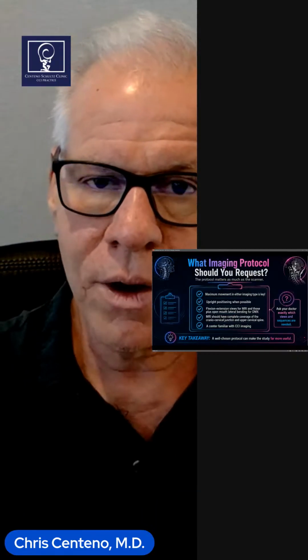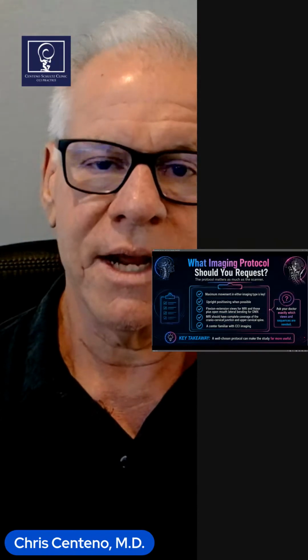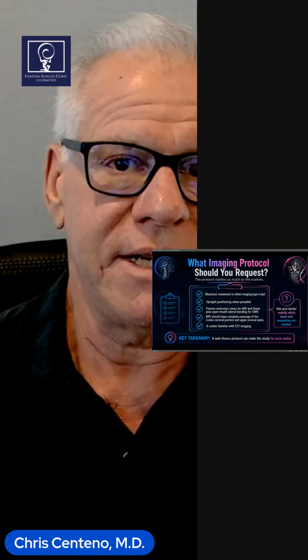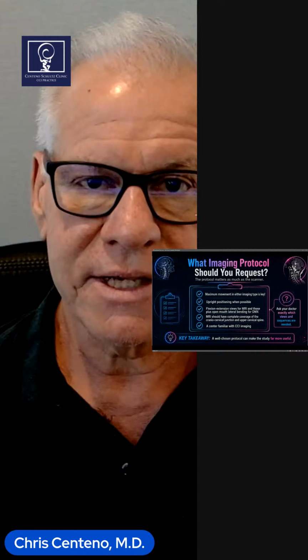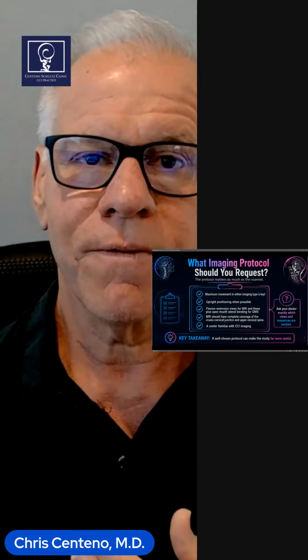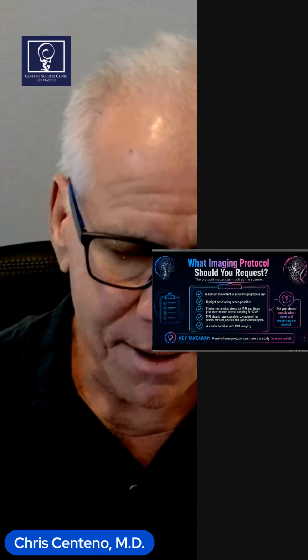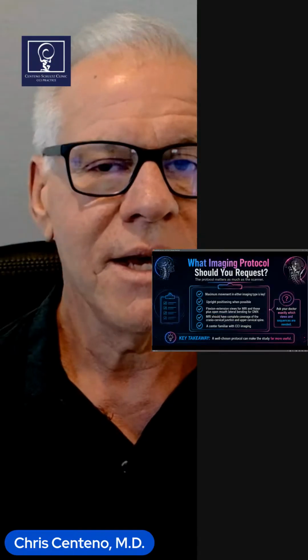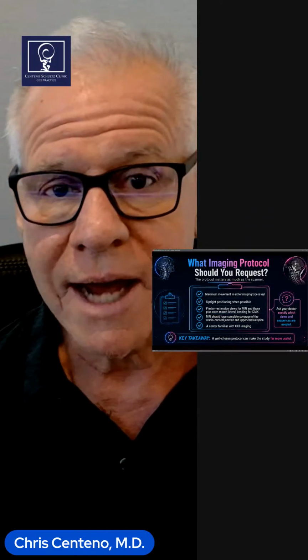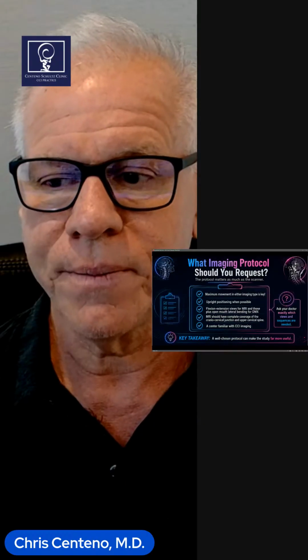And as a corollary to that rule, it's maximum movement. So if we were going to look at a CBCT, great, it should have flexion and extension. But the problem with CBCT is it's got a limited field of view. So frequently there'll be a maximum range for flexion and you'll have to stop against something, and a maximum range for extension and you'll have to stop against something. Not ideal for detecting craniocervical instability and movement-based imaging in general.